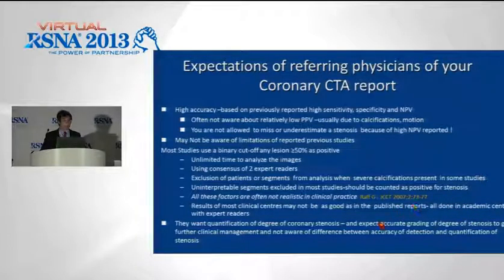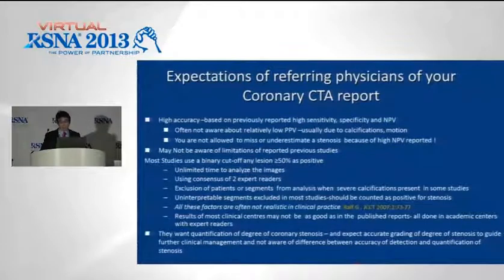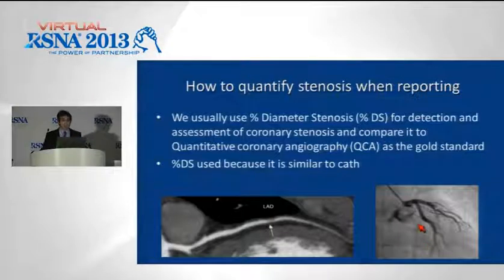At the same time, your referring physicians want quantification of the degree of stenosis and expect accurate grading of the degree of stenosis to guide further clinical management, and they may not be aware of the difference between the accuracy of detection and quantification of coronary stenosis. How do you quantify coronary stenosis when reporting?